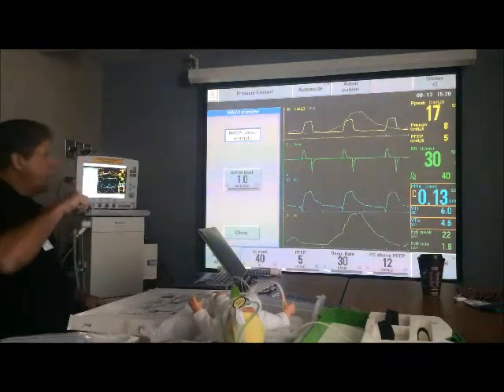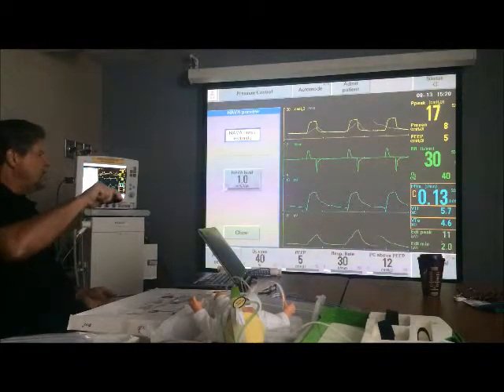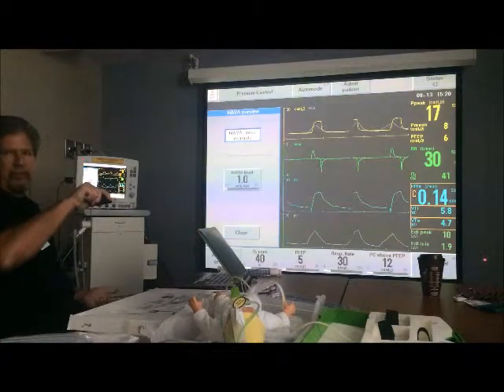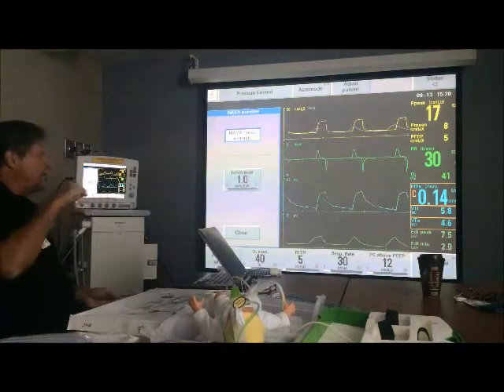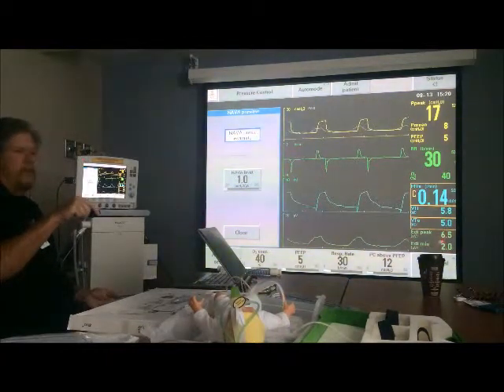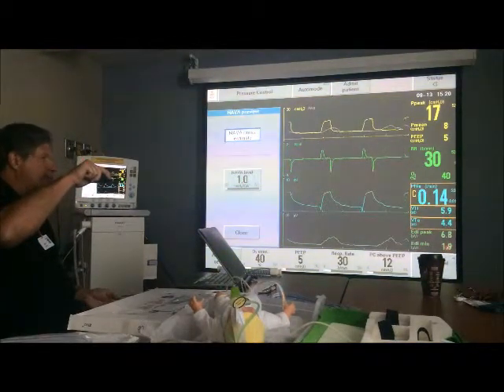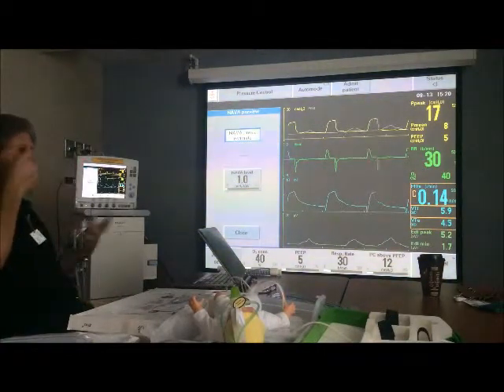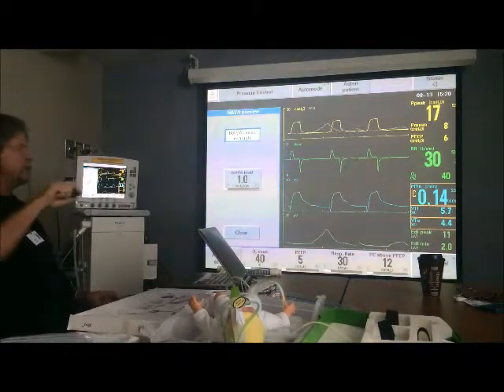Okay? But most of the time, when we're not dealing with tonic activity, this number is usually pretty close to 0, or could be 0.3 or 0.5. So it's negligible, and with not very much error you can say it's basically just 1 times whatever the peak is. But in reality, the ventilator is subtracting the min from the max and then multiplying the number by the NAVA level.